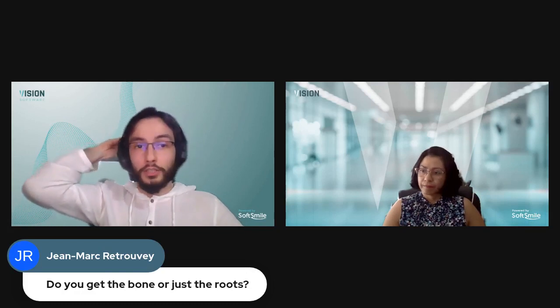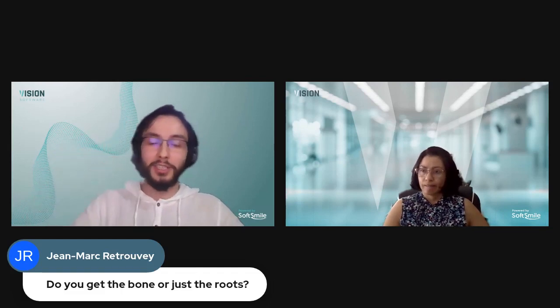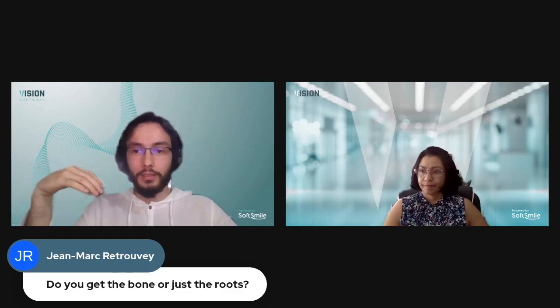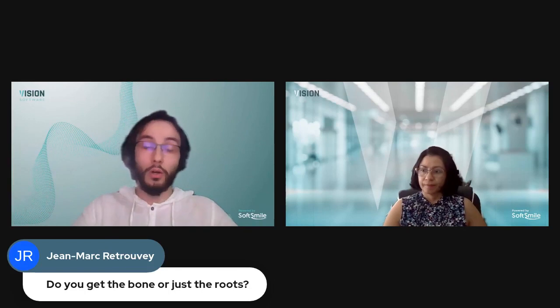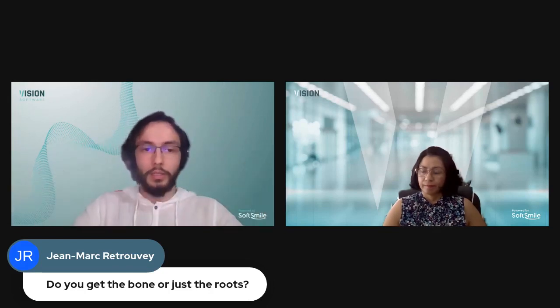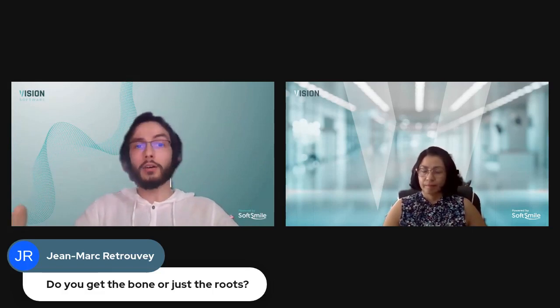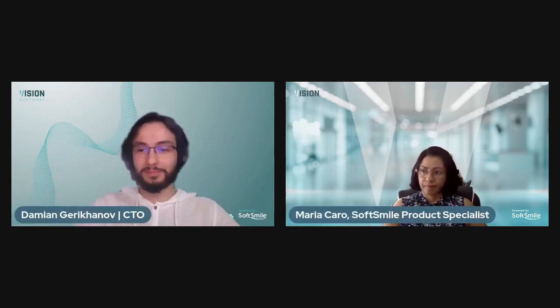Oh, that's a brilliant question. For now, we only handle roots, but the bone is coming. So we've currently focused on the roots only. And the upcoming release of this functionality, the next release, will also feature the mandible as well as the temporomandibular joint to give you a much better idea of how bite jumps and articulators may work. So for now, that bone is not there. It's coming.